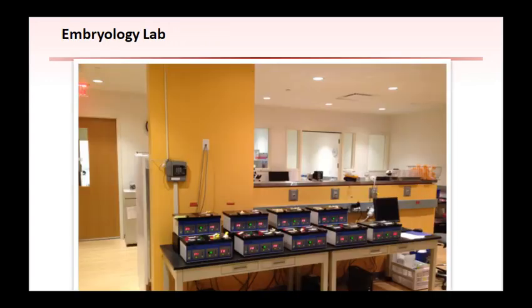Incubators should be easily accessible and at an appropriate height. They must be alarmed, and generally an uninterruptible power supply device and/or backup generator should be present in the event of loss of power. This lab has a high-efficiency particulate absorption, HEPA, and carbon-filtered air supply in order to minimize the risk of contamination from dust and decrease the amount of volatile organic compounds, VOCs, in the air.